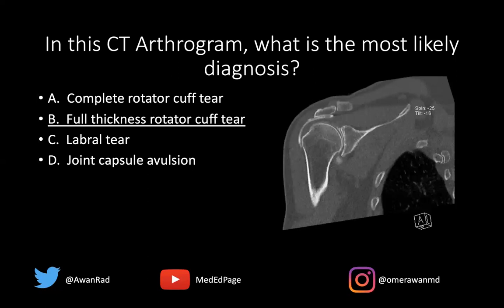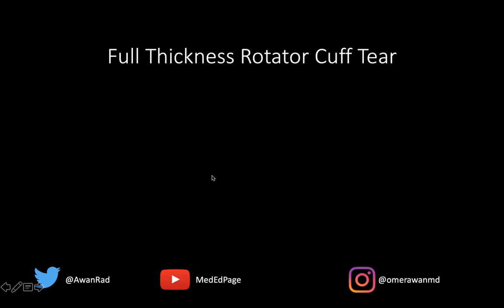Now, this is not necessarily a complete tear, because a complete tear is a full thickness full width tear. This is a full thickness tear, but not necessarily a full width tear. We don't have a sagittal image to assess whether this is a full width tear, so we can only be confident that this is a full thickness rotator cuff tear.